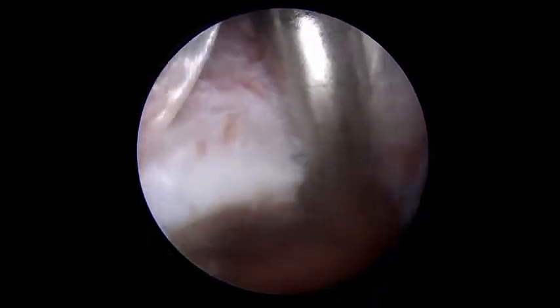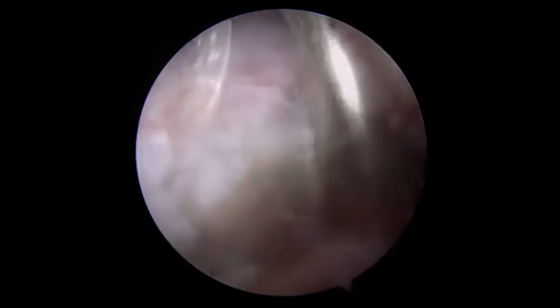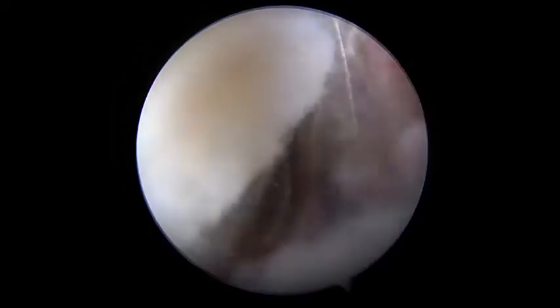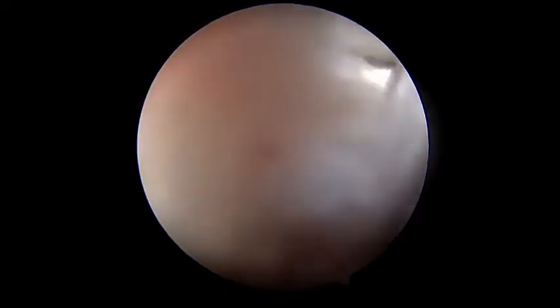The inferior labral tape is then passed through a 4.75 Arthroscopic peak swivel lock. The swivel lock is then implanted at the junction of the inferior 1/3, upper 2/3 of the lesser tuberosity footprint.